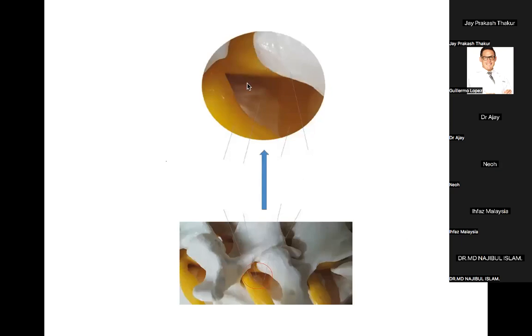So this is what we see. I mean, we don't see, but we have to. The patient lies in the prone position. In the prone position, we have the foramen like this. This is the lower part of the foramen. This is the upper part of the foramen. Which root is this? Exiting nerve root. And this one is the traversing nerve. And this is the SAP.